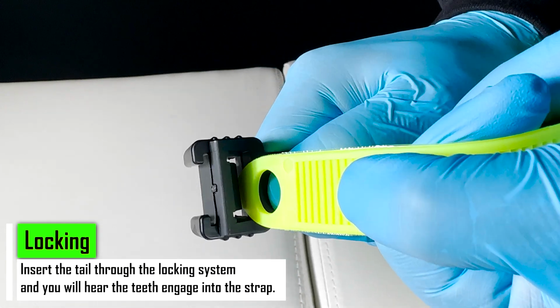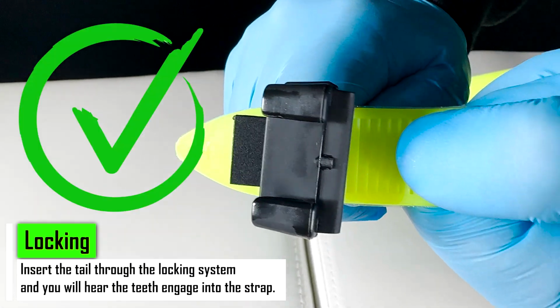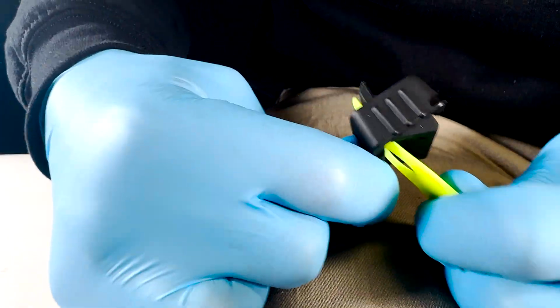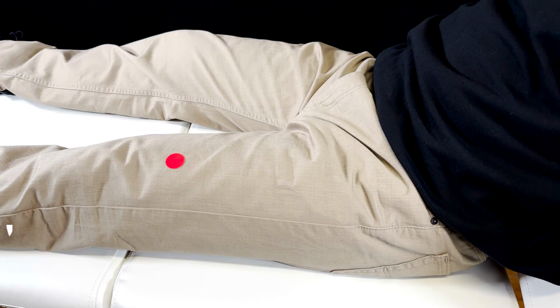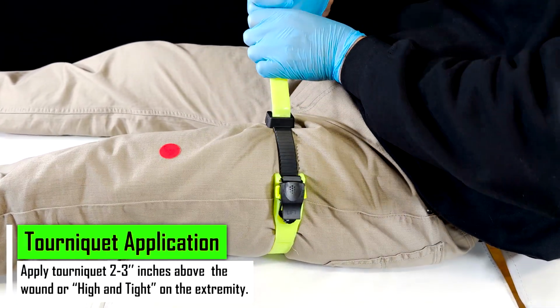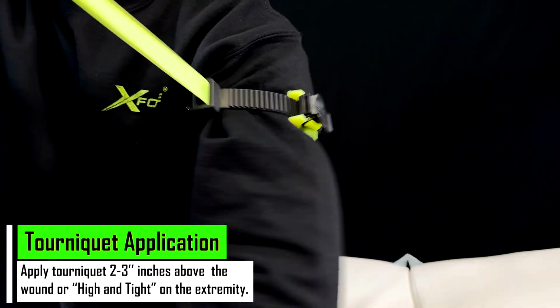Locking. Insert the tail through the locking system and you will hear the teeth engage into the strap. Tourniquet application. Apply the tourniquet 2 to 3 inches above the wound or high and tight on the extremity.